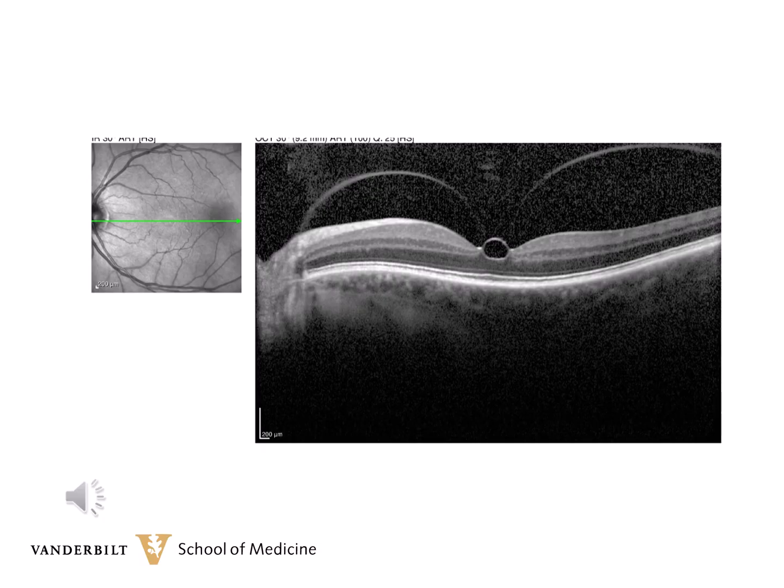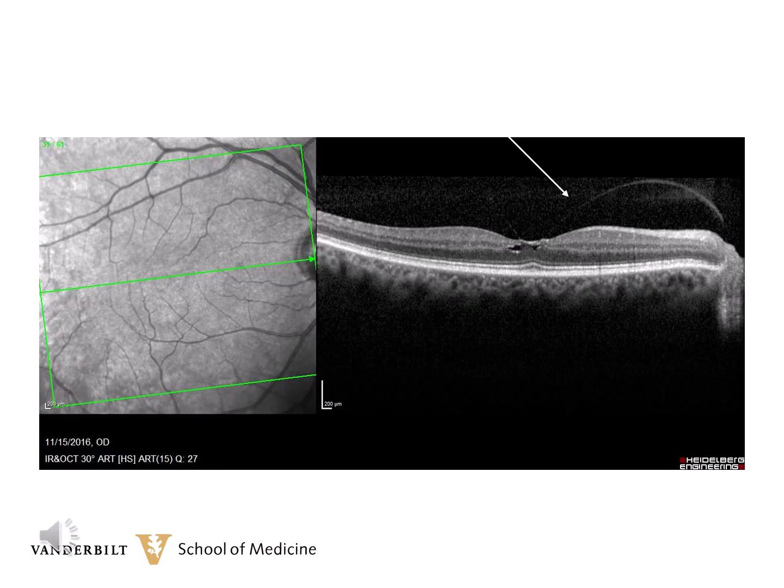However, you can see very clearly that the retinal defect now is anterior and not in the outer layers. This is a 54-year-old female who had a decreased foveal reflex, and you can see the inner cyst. The outer layers, the photoreceptor layer, is absolutely normal. The cysts do not always have to be so prominent as on the last case.